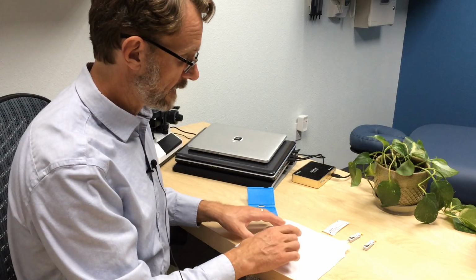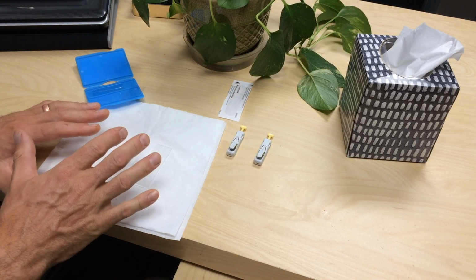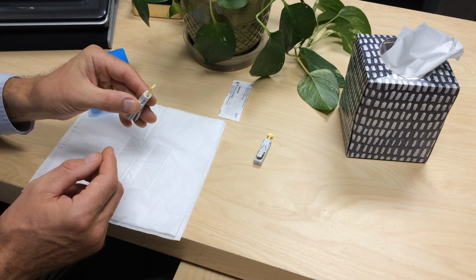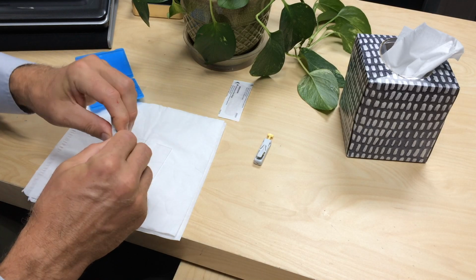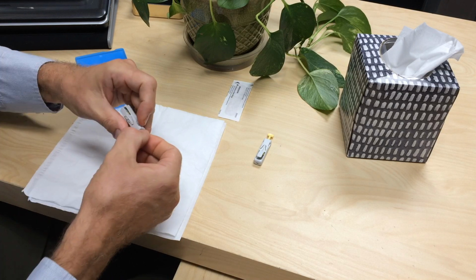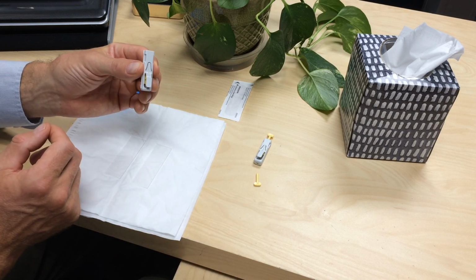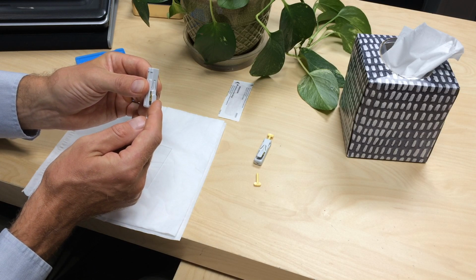Then go wash your hands. Once your hands are dry, come back and we'll begin the procedure. After your hands are clean and dry, come back to your station, and this is where you're going to load the lancet. So take one of these lancets, apply pressure to the yellow tab, and rotate it several times while you're still applying pressure, and then remove the yellow tab. This lancet is now loaded and ready to be used. That is the button that depresses the lancet.